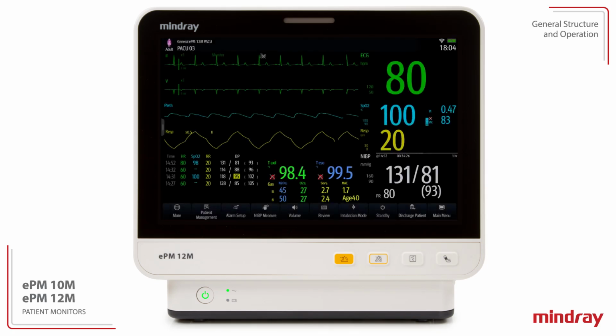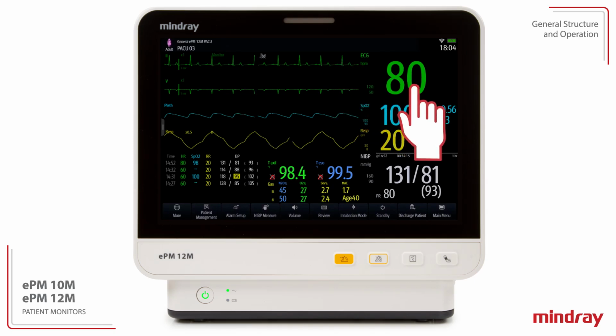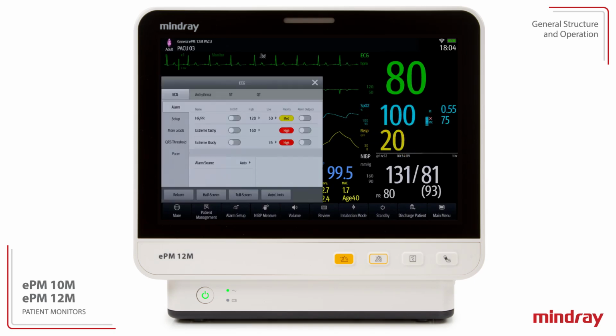Each parameter displayed on the screen has an easily accessible dialog for review and adjustment of parameter-specific settings. Enter the dialog by selecting the parameter waveform or numeric area. All dialogs have similar style and structure. The dialog heading specifies the parameter.